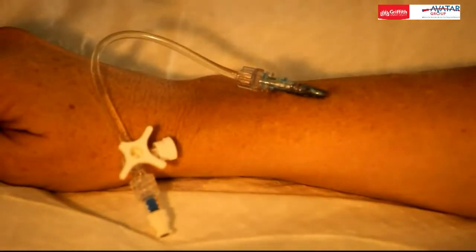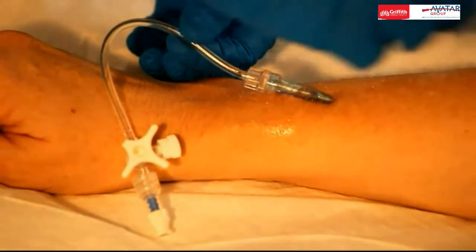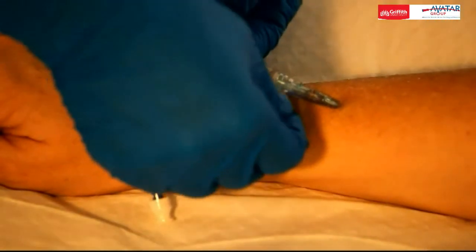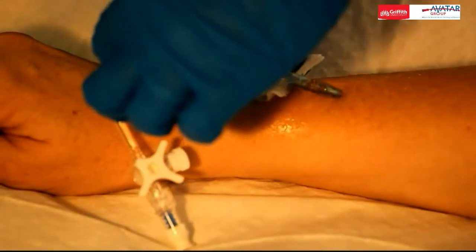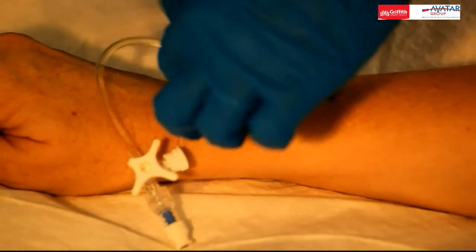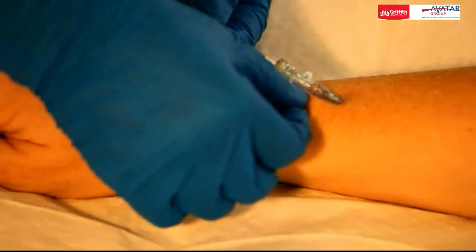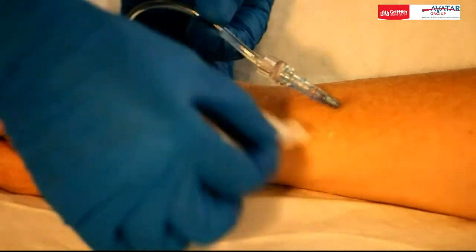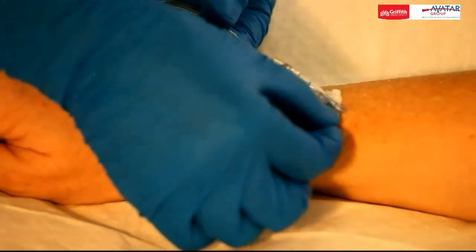And this is a PIV that was only just placed, so the glue is as firm as it's ever going to get. It does tend to disintegrate after a few days. It's usually just a fine white powder. Bearing in mind this is the most you'd ever have to remove, she's just using an adhesive remover, those little pre-packaged wipes you can get, but you can also even use paraffin to take it off. We haven't seen any more skin tears or any more irritation than we see with standard transparent dressings anyway.